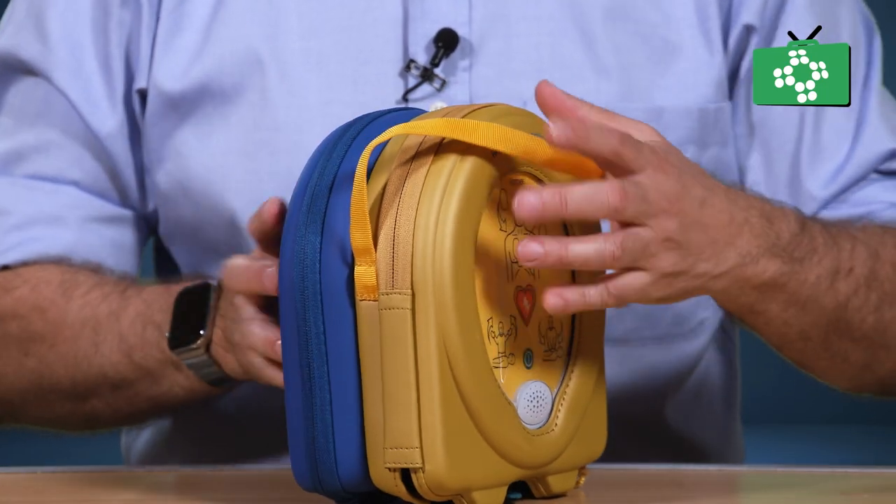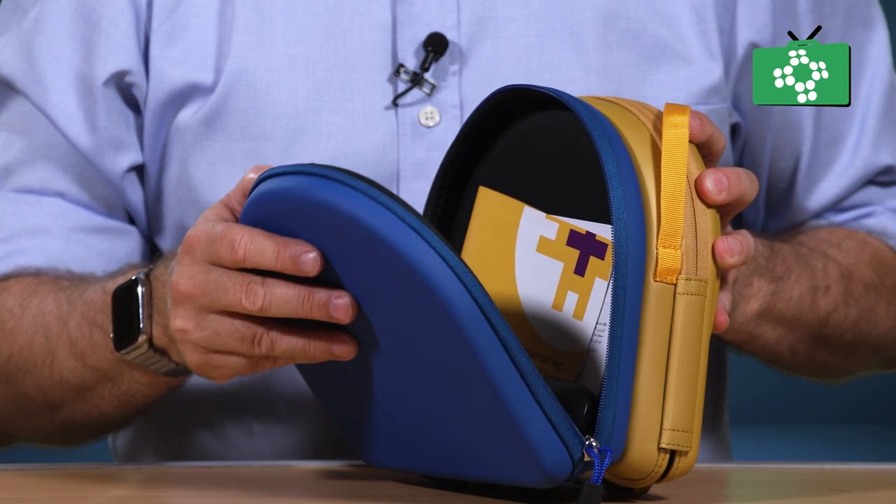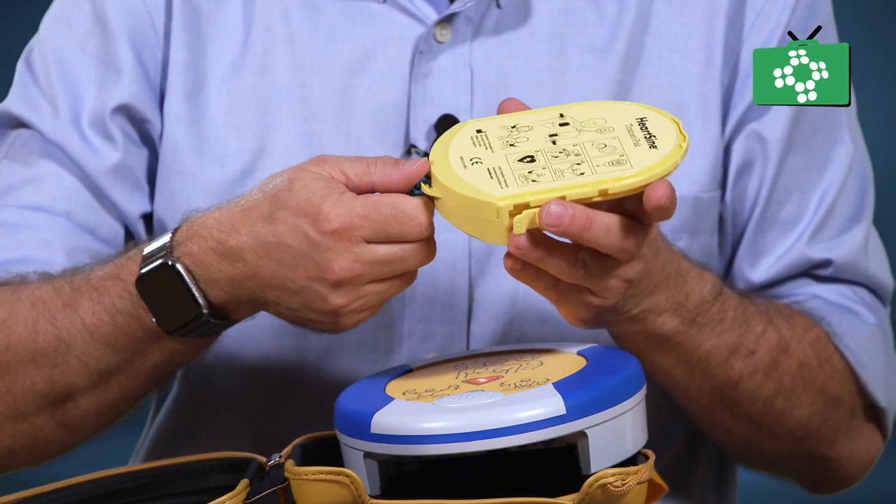When checking the unit, open the case and make sure everything is there. Make sure the pads are there and the instructions are in the case. Check the pads and make sure the seals are not broken.